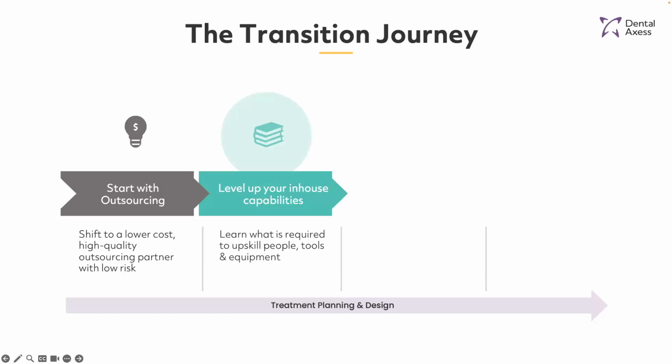Now, once you feel comfortable with assessing plans, you may want to consider leveling up your capabilities to design yourself, especially for some of the simple cases. We provide training and advanced treatment planning techniques. We can help you invest in essential tools and equipment for in-house clear aligner treatment. And depending on your needs, we'll set it up in a way that can benefit you.